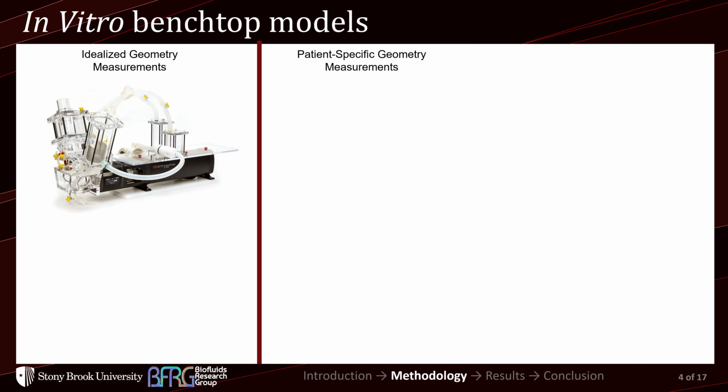So for testing aortic valves, we use a benchmark called the ISO 5840-3. This ISO standard is for evaluating both the hydrodynamic performance of the valve, both the systolic and diastolic performance, as well as the durability of the valve over time. I'm going to be just addressing the hydrodynamic testing, which is how you would benchmark the valve against other valves and really evaluate its pluses and minuses.